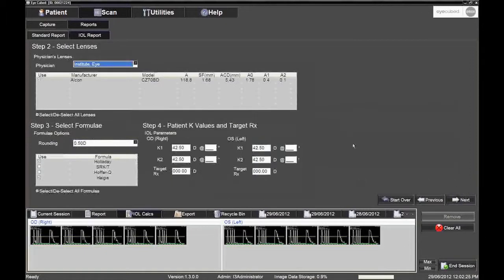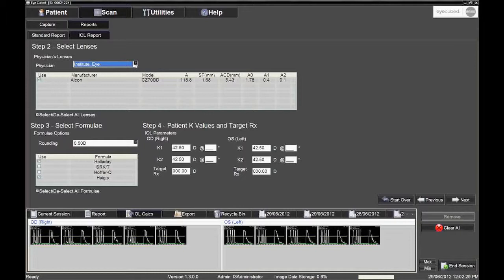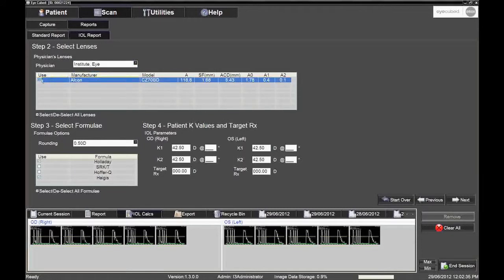Step 2. Select Lenses screen now appears. Highlight the appropriate physician on the drop-down menu and select desired lens. These lenses have been added to the database at the time of initial instrument setup.